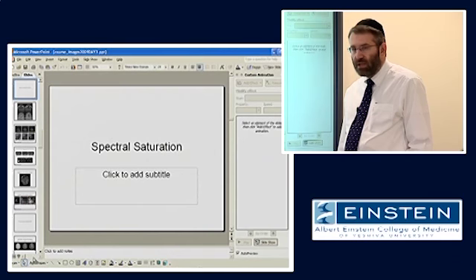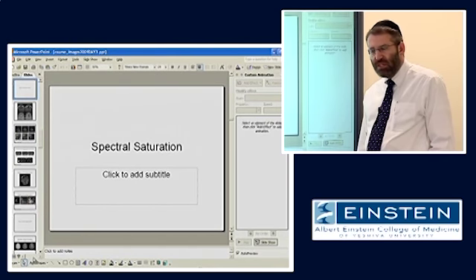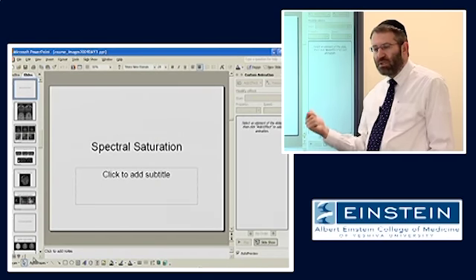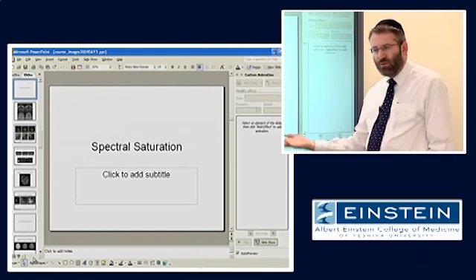Well, no, not necessarily. In fact, it may be more sensitive in subacute subarachnoid hemorrhage, perhaps, than CT, because CT is definitely less sensitive as time goes by. But as long as there is some residual something, whether it's protein or whatever it is, in the CSF, you'll have this effect.